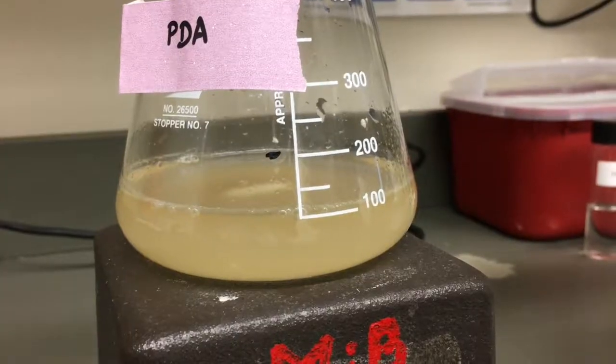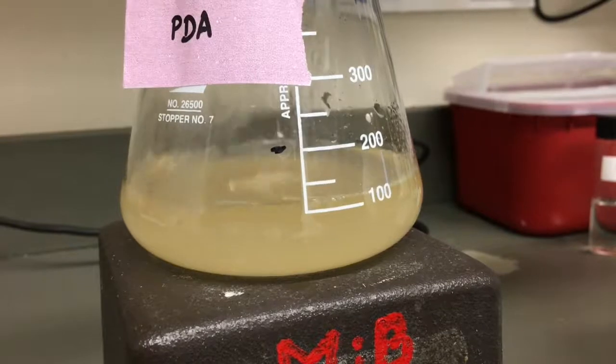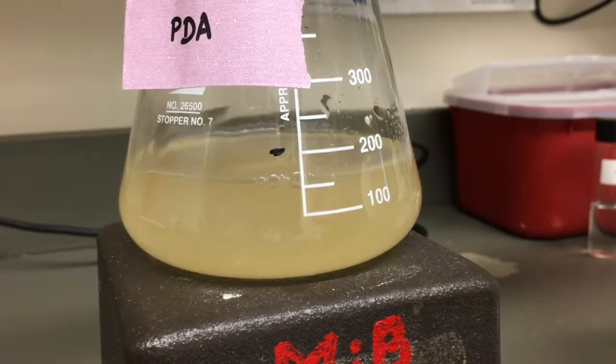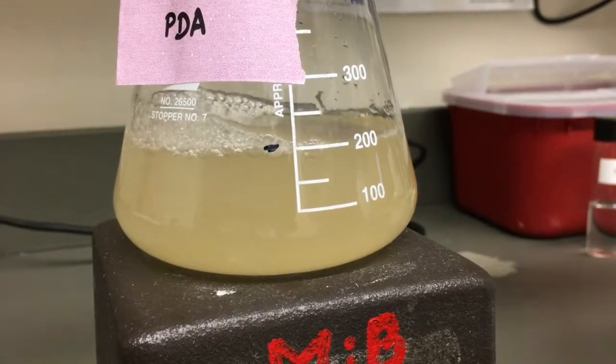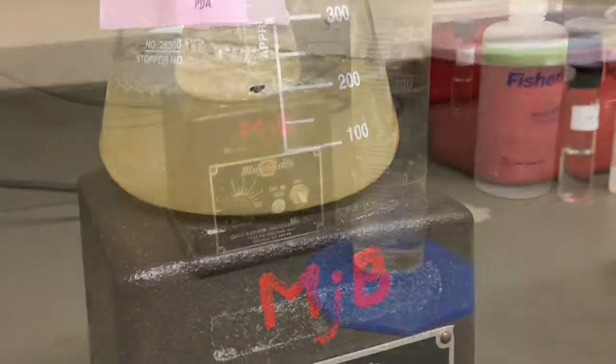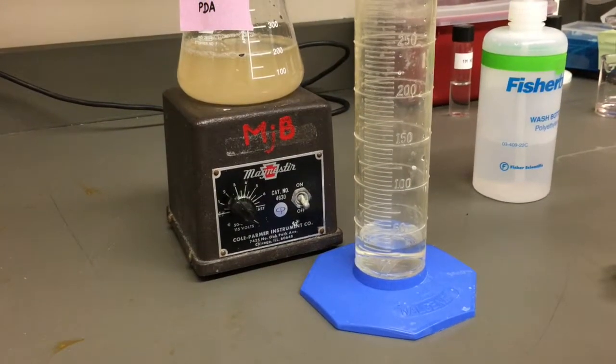Once all the powder has been added and dissolved in, add water to bring your solution up to the required final volume. If you had added the exact amount initially, you can see you would have a final volume larger than what was required and what you had calculated for.